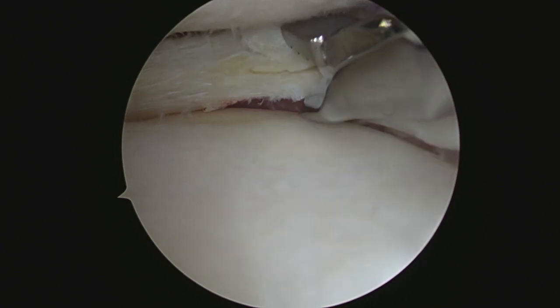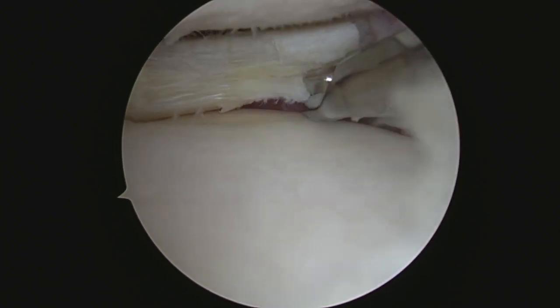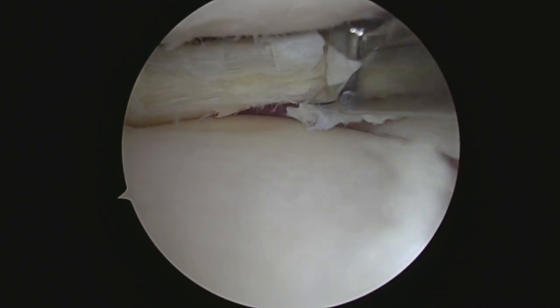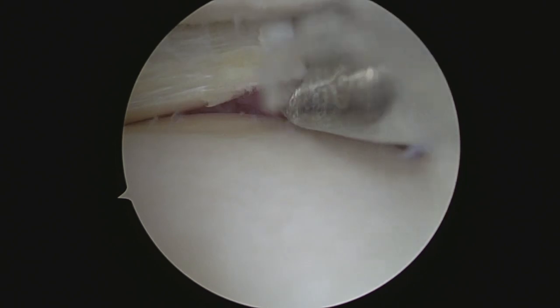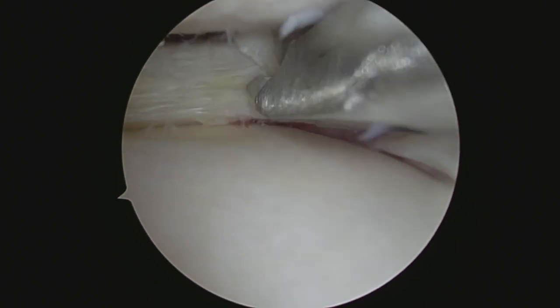Alright Roselle, just going back right towards the apex. You could see it's split in the middle here. We're going to trim out the bottom part here a little bit to give us some room to access the top. So we go over the top here, and we're going to connect to where we started. It's a different angle I'm using that lets me get on top of this a little bit better to make sure I get that meniscus fully resected for you.